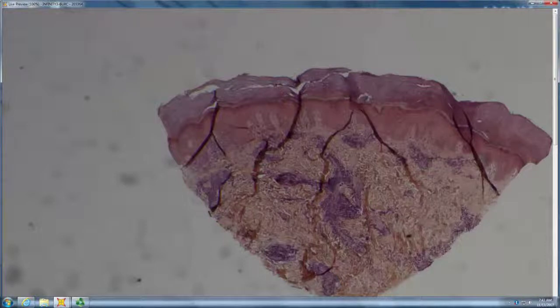Urticaria, right? There's no karyorrhexis, so it's not vasculitis, right? Vasculitis, the L in LCV is leukocytoclasis. So if there's no L, there's no LCV, right? So there's got to be fragments. What else looks just like urticaria histologically?